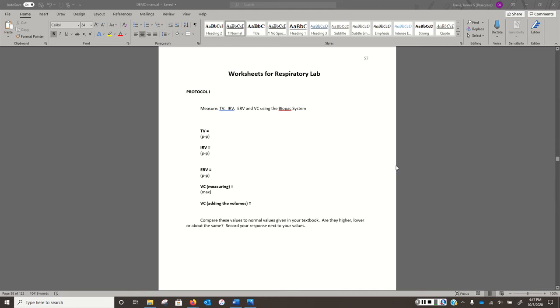your own. So the biopack part, similar to the biopack that we used for the EKG in two of our earlier labs, it's the same device. We're just going to hook up a spirometer, which is just a device that you breathe into, and it measures things like your breathing volumes, your breathing rate. So we're going to see what kind of readout we have when I did it.